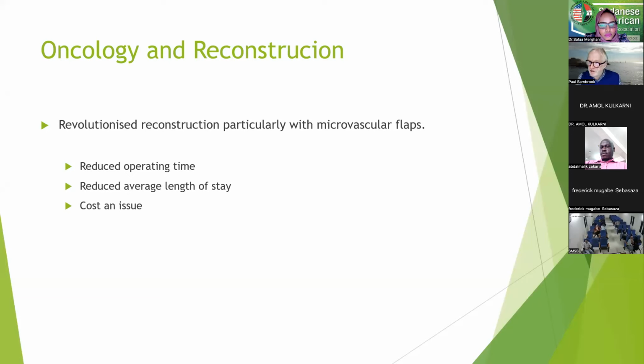Although cost is an issue, in general, the costs that are realized in terms of reduced operating time and reduced average length of stay more than compensates for the cost of the virtual surgical plan.